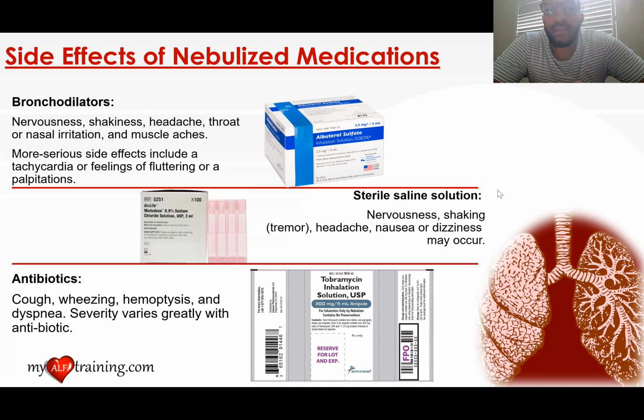So if the patient spits blood after receiving an inhaled nebulized antibiotic, then we know that that's normal. That's something they can expect. And we can even tell them before they receive the treatment so that it's something that they expect. So when and if it occurs, they don't panic, they don't freak out. We told them that this might happen, and it did. So if anything, we're already two steps ahead, and we're taking great care of our patient because we told them that this is what they can expect and it's normal.